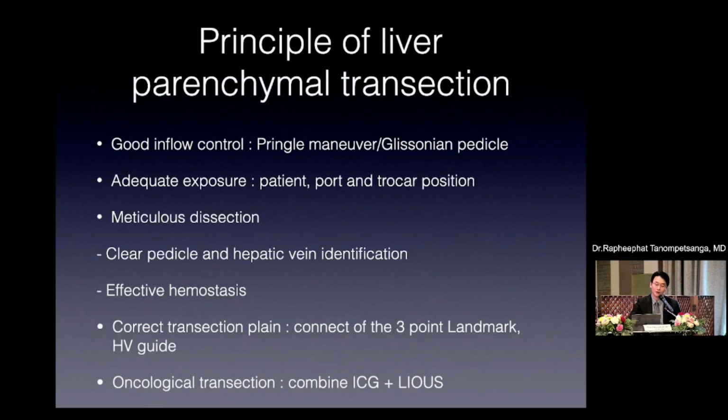For the conclusion, the principle of liver parenchymal transection: you have to make good inflow control, adequate exposure, meticulous dissection, and have the correct transection plane and oncological transection.